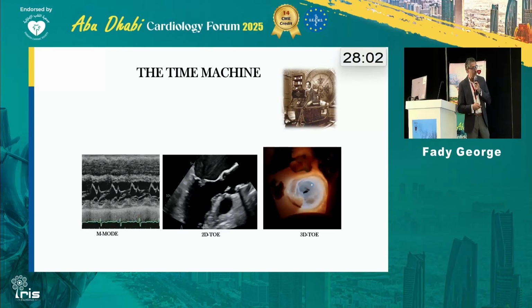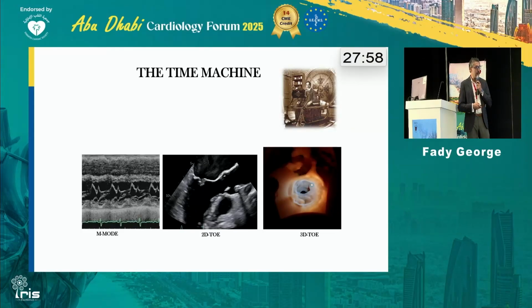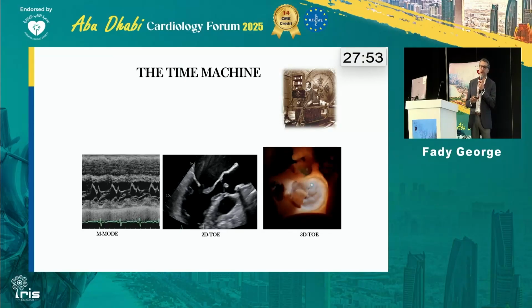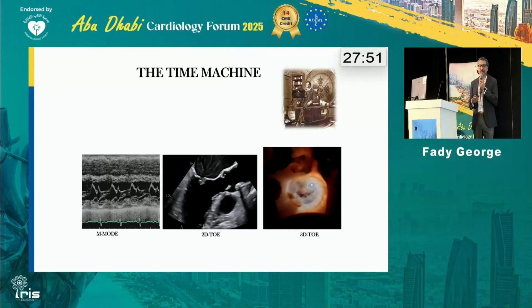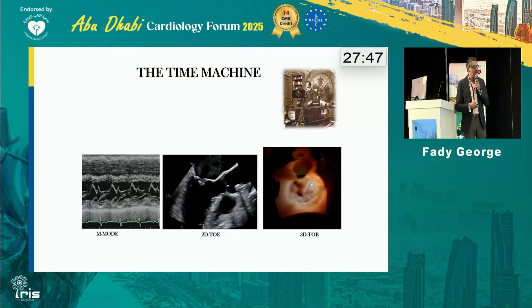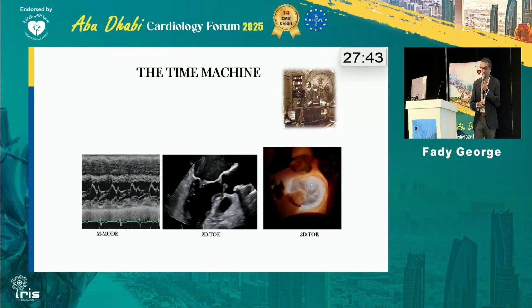And then after 10 years more, we got to find something called photorealistic view of the mitral valve, which is basically a trans-illumination of the echo probe where you can reflect lights on the mitral valve while you're intubating the patient with the probe, and you can see everything in details, specifically just like the surgeon view.